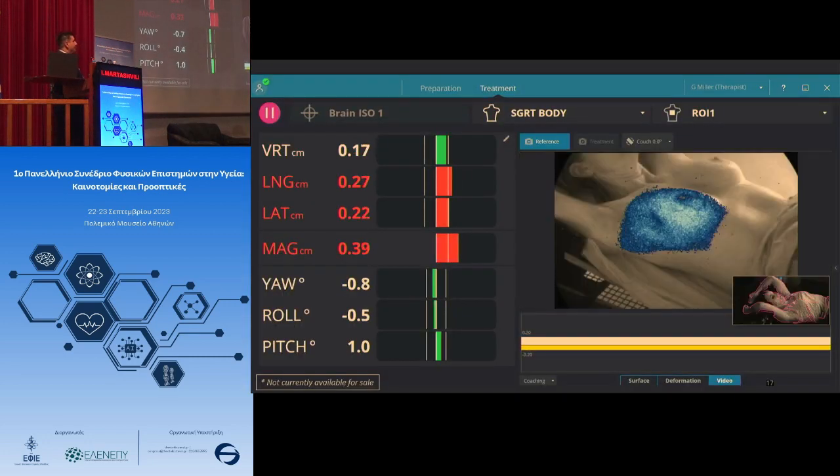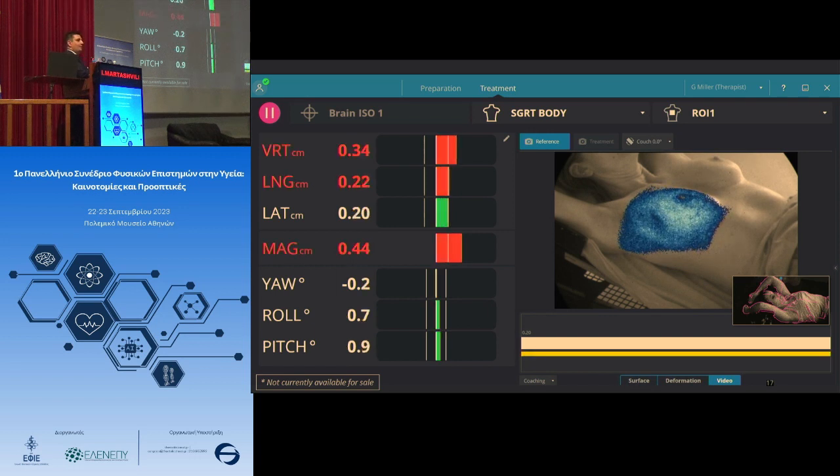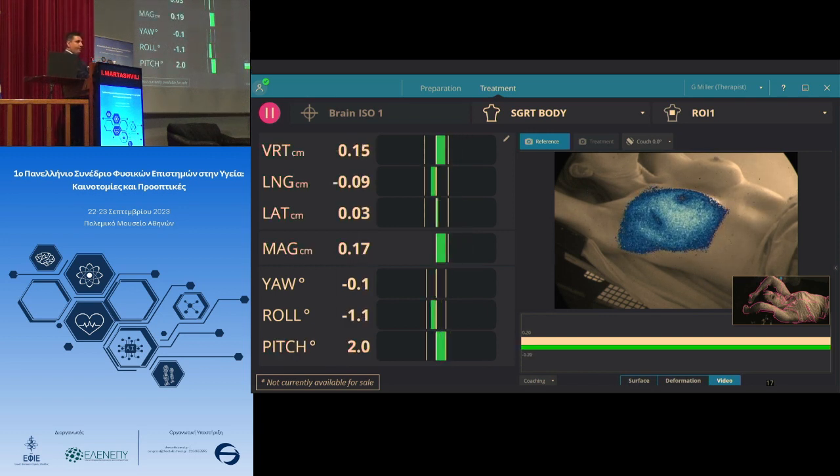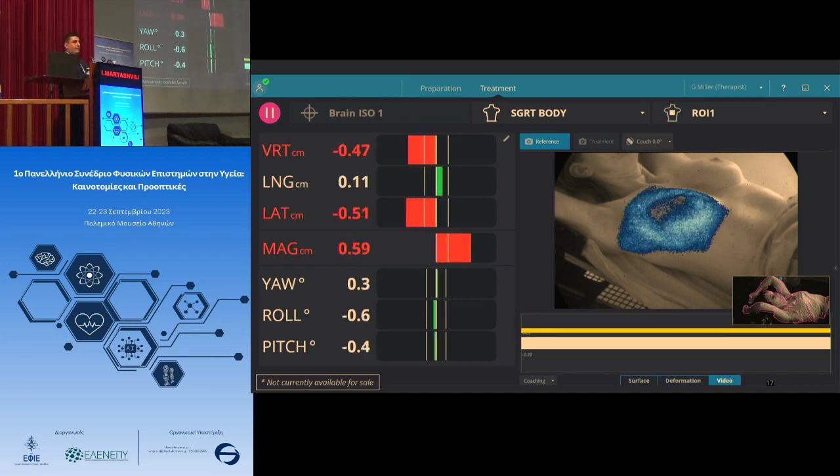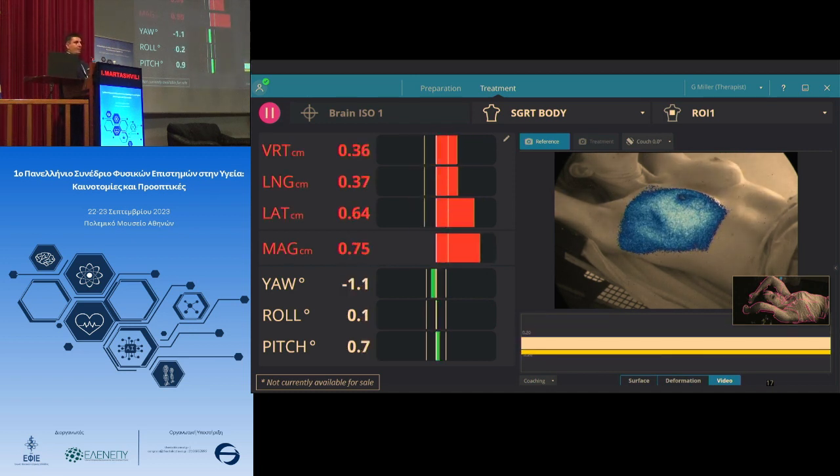Okay, so this is the idea, this is our vision. Basically, monitor the patient's position, posture, and also the beam delivery in real time with SGRT technology that expands the usage and utilization of such techniques for SRS and SBRT patients, where it especially counts, where you would really want to know your patient's motion management. Thank you.